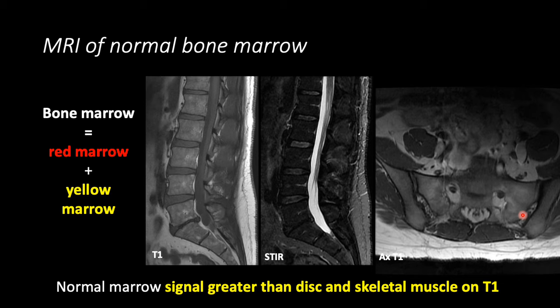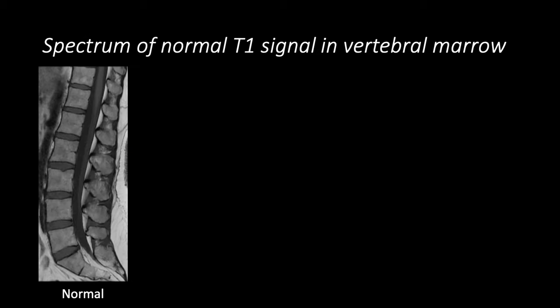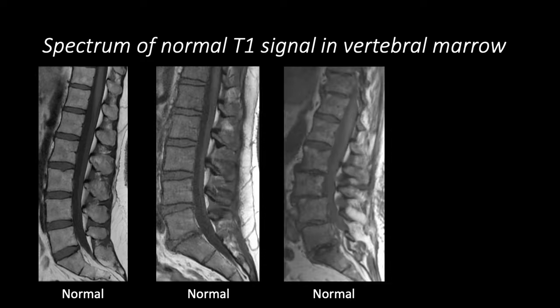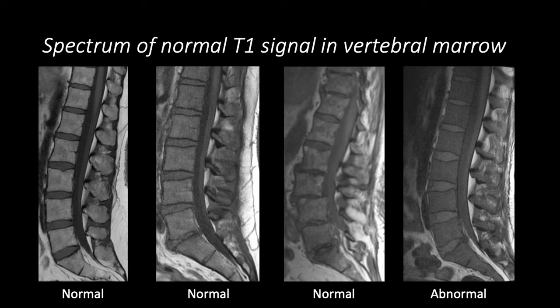Note that bone marrow changes with age. In younger patients, there is a greater proportion of hematopoietic or red marrow, so the bone marrow will be relatively darker than in an older patient who has a higher proportion of yellow marrow. Try to become familiar with the normal signal intensity of bone marrow on T1-weighted images. In all normal situations, the bone marrow is brighter than skeletal muscle or disc. This is an example of abnormal bone marrow: it is diffusely hypointense or dark on T1-weighted images, darker than skeletal muscle and darker than disc, in a patient who has ALL.